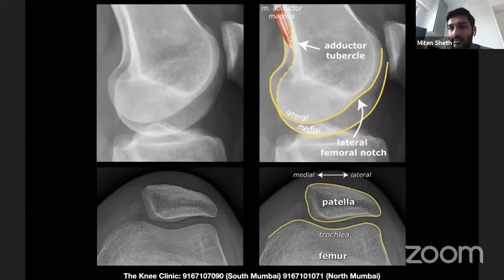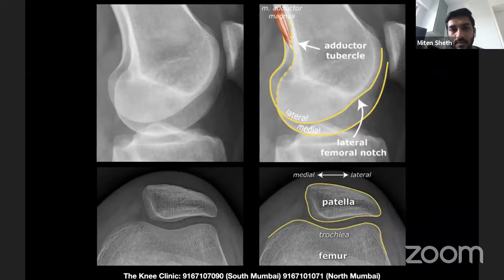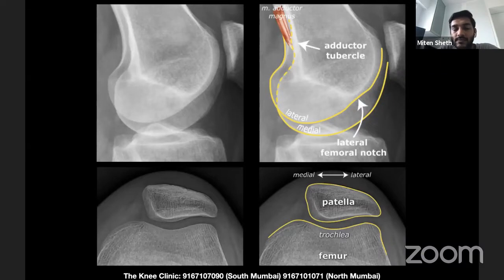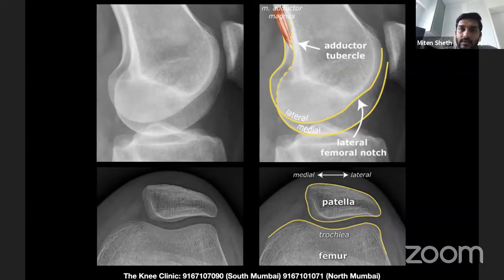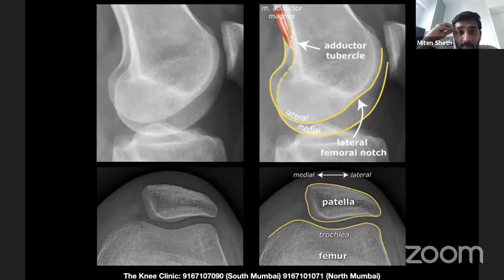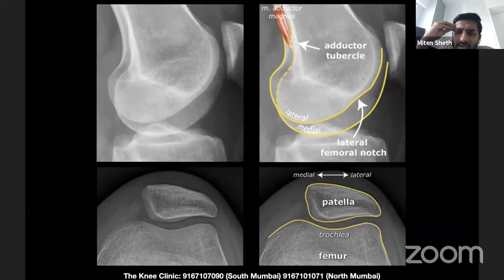On a slightly rotated lateral view, it's imperative to identify which is the medial and which is the lateral femoral condyle. There are two keys: on the posterior cortex, one condyle has a small protuberance called the adductor tubercle, where the adductor magnus attaches — this is only on the medial femoral condyle. The other marker is the lateral femoral notch: a small indentation always present on the lateral femoral condyle, never on the medial one.